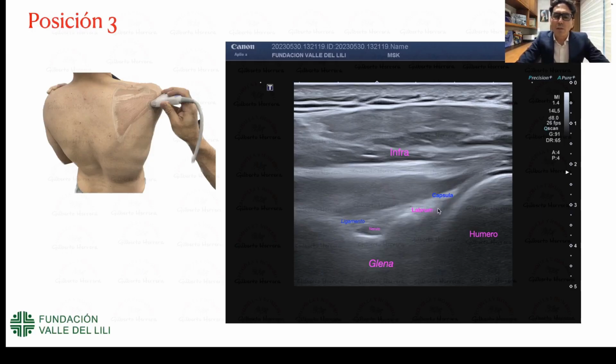Remember that ultrasound is not an exam for evaluating the labrum. Here you can see some lesions when they're in this area, but the study of the labrum is done with an MR arthrogram. We can look at the acoustic window of our joint. So this position allows us to perform interventions and describe the anatomy. So we can see our glenohumeral joint in position.